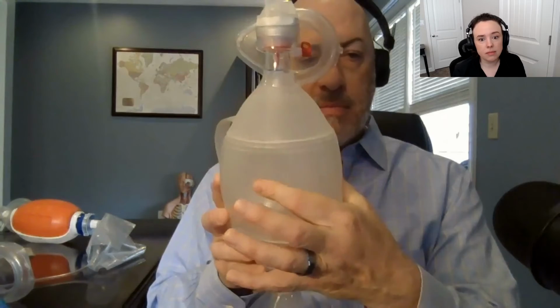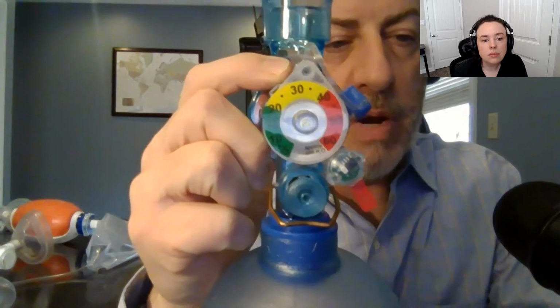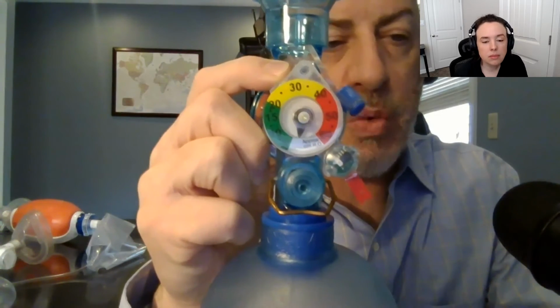So how do we fix that? Again, you can be very disciplined and take your regular BVM and just go like that over a second or so. That's great. Or you can buy, for example, the CPR2 BVM. So if you watch, I have to cover it up. There's a manometer right there. And when I squeeze, you see how it's in the green, goes up to 20.